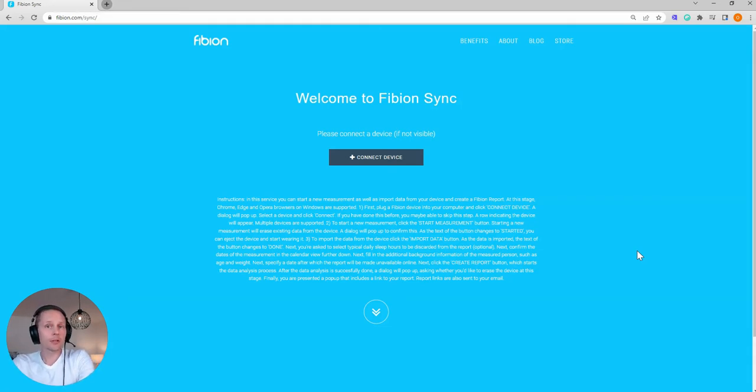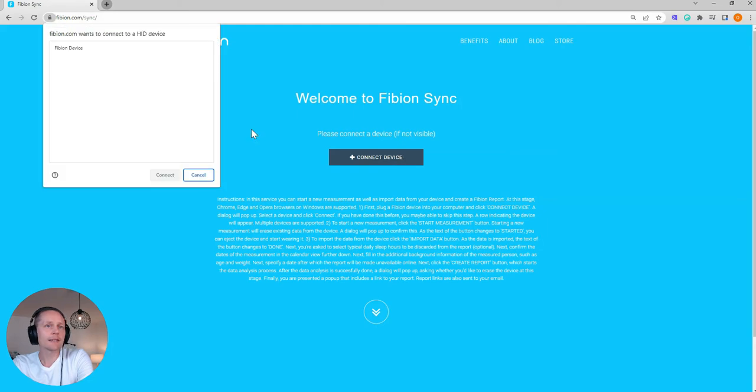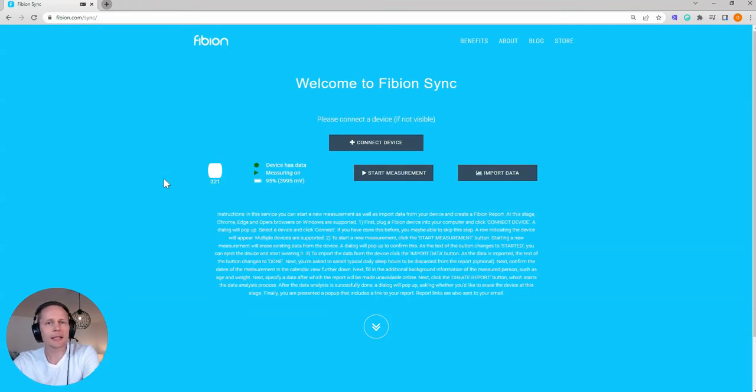I can click 'Connect Device' and I can see that there's a Fibion device here. I click it — sometimes you might see that it's listed as an unknown device, but you click that one anyway. I click connect and I can see that I'm connected to device number 321. The device has data, measurement is on, and I have a battery status of 95%, which is about one month of measurement.